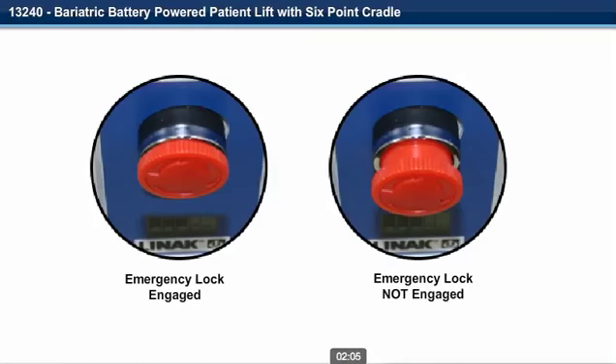Step 14. Verify that the emergency stop button is not pushed in. If the emergency stop button is pushed in, turn the button to reset it to the out position. The emergency stop button has to be in the out position for the lift to operate.